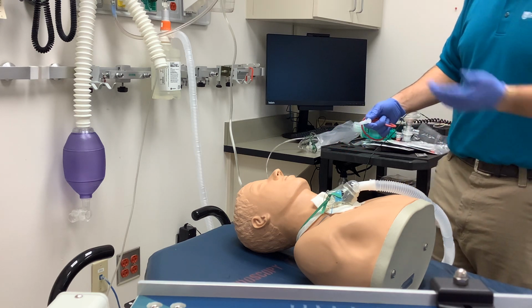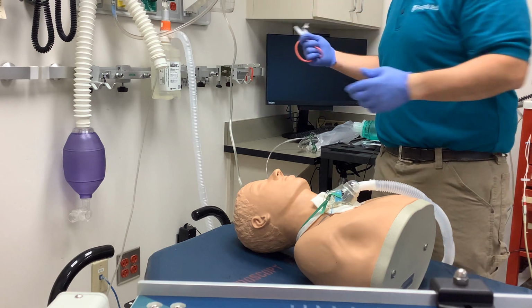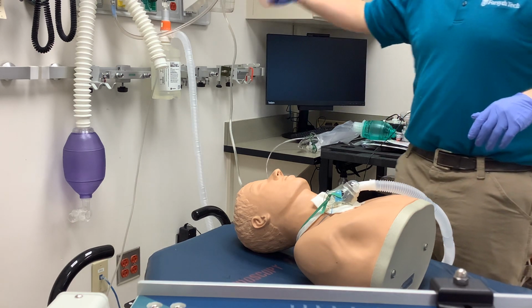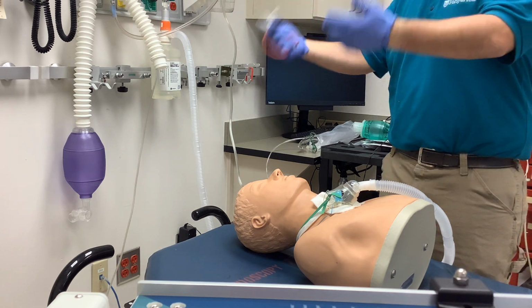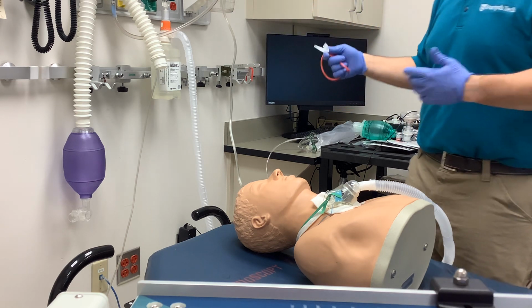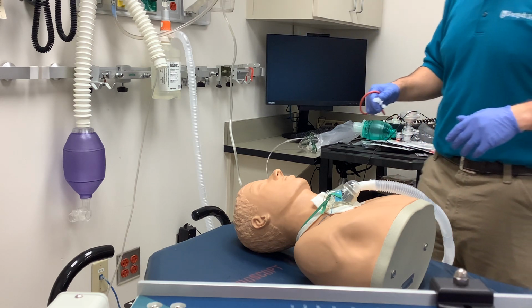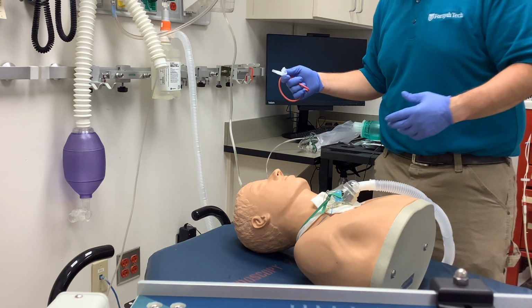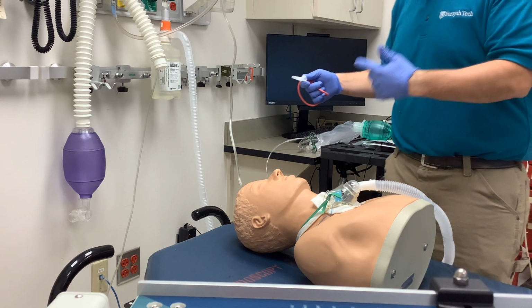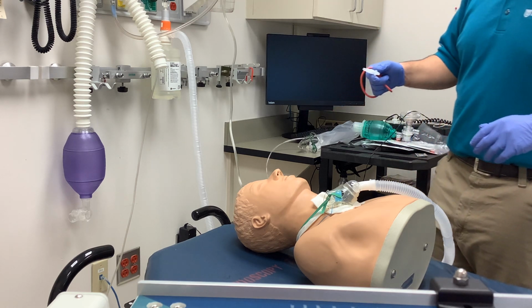So I would go ahead and max out your flow meter if you're going to be doing that, switching it over. That way you're providing, because this flow meter is calibrated at 15 liters per minute, but it can definitely put out more than 15 liters per minute, but it's calibrated to let you be able to measure 15 liters per minute of flow. So I would max that out, have your patient breathe in as much 100% oxygen as he can for your hyperoxygenation procedure. You're assessing your charts, talking to your patient, letting them know what's going on.